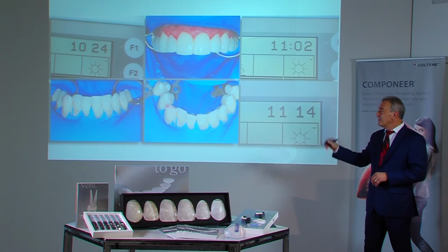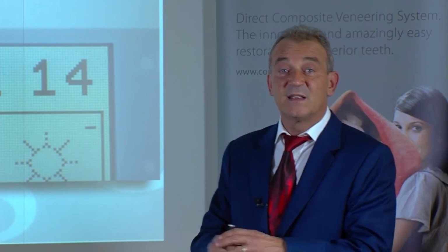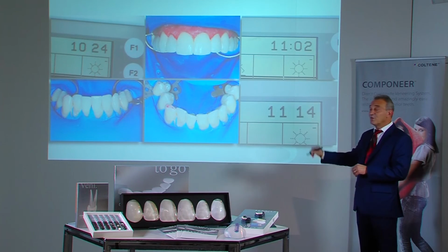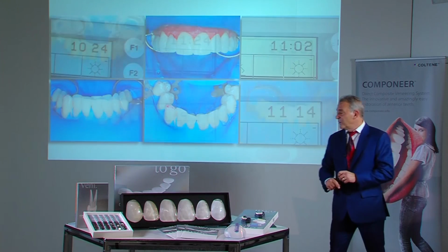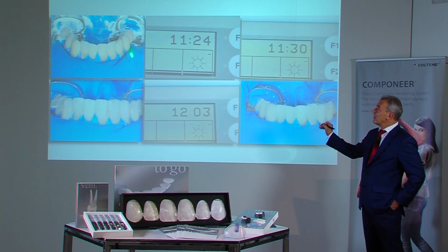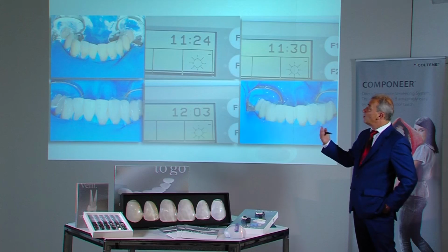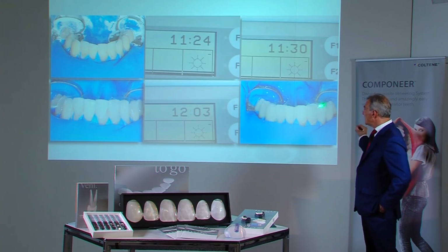Lingual gluing is not necessary in this case. Stretching the rubber dam to buccal, it holds lingual contact and isolates the work field. Buccally, we have the freedom of conditioning and being able to work up to the cervical region of the gingiva. By and large, we only sandblasted as the occlusion made this possible in this instance, placed the componeers on the teeth and corrected the line. All componeers are placed.